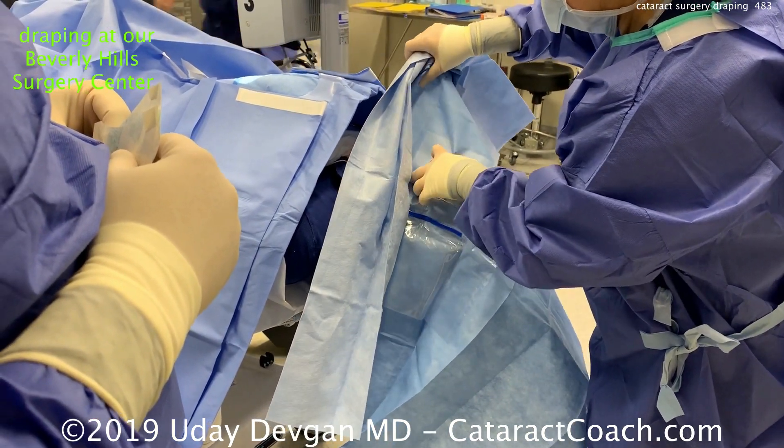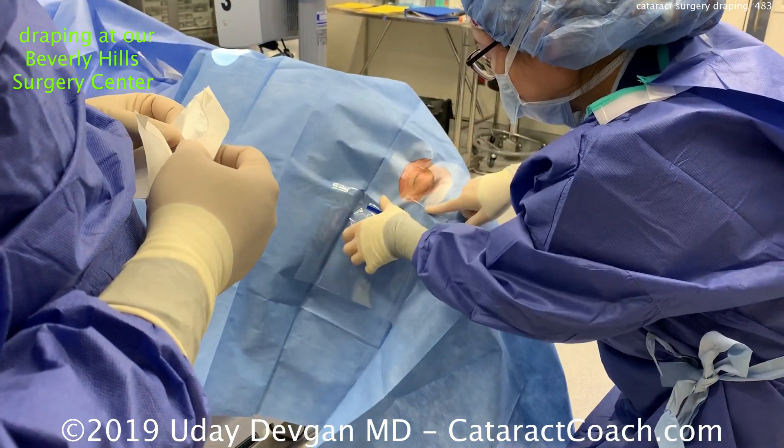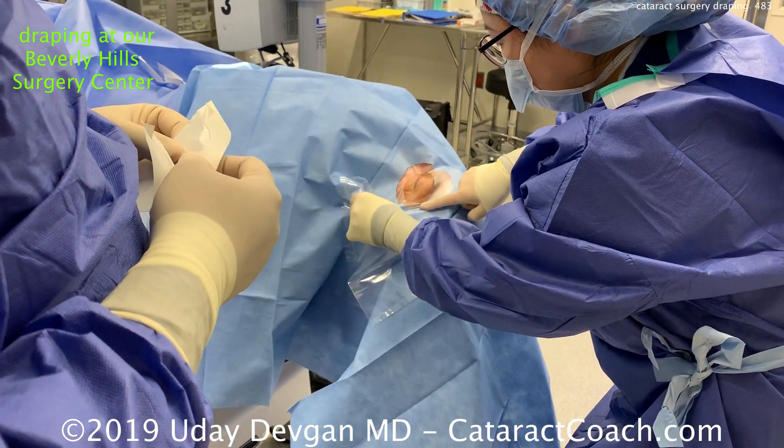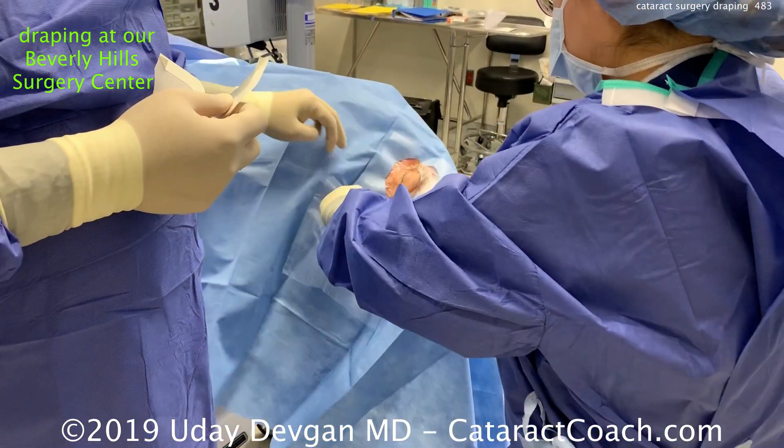We place this first drape that has a cutout for the eye in its adhesive, and that sticks around the face and has a nice seal, and the eyelids are now exposed. We don't touch the eyelids — we're just touching the drape.